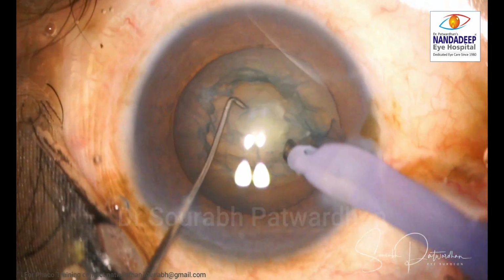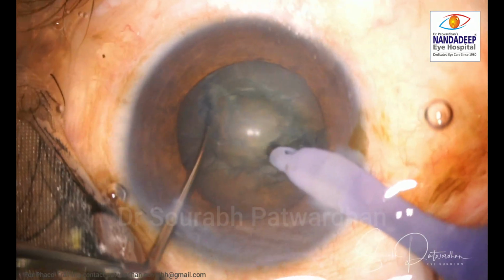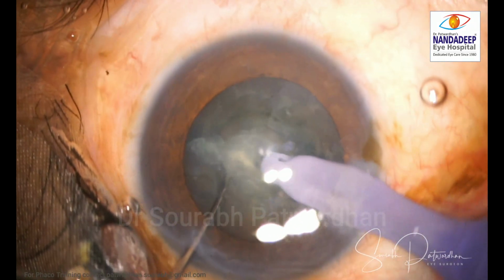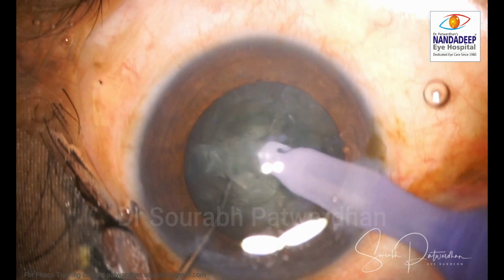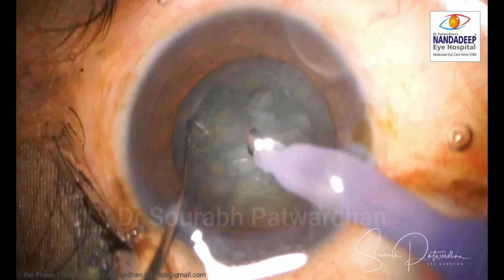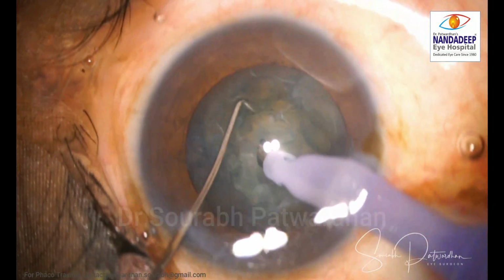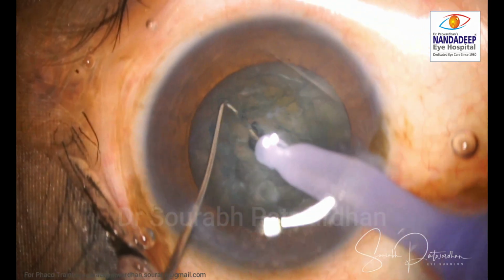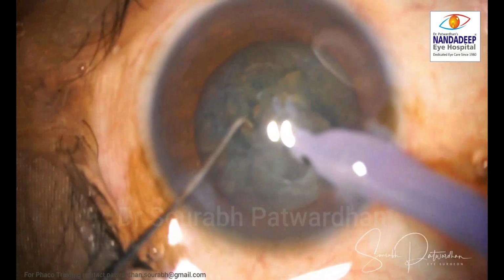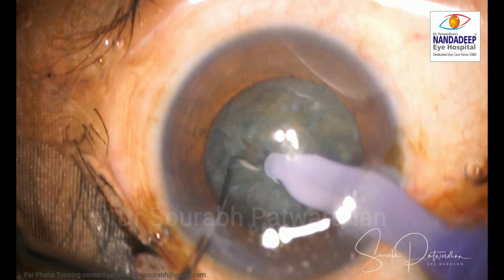There was slightly deeper anterior chamber on the left side, which I felt, but I thought it may be normal, and I started off trying to do chop, and I could feel that there was no support from the back, and in fact the nucleus appeared to be deeper than what I started off with. I still thought it might be just loose zonules, or maybe sclera is little more elastic, that's why it's happening.